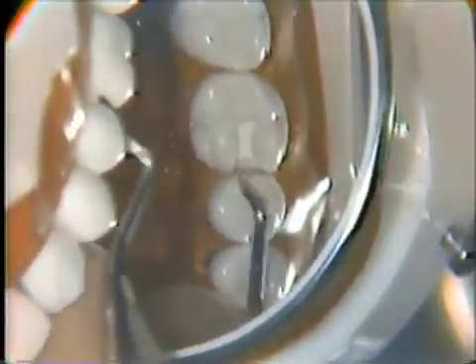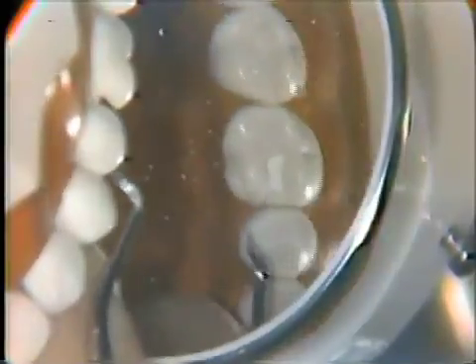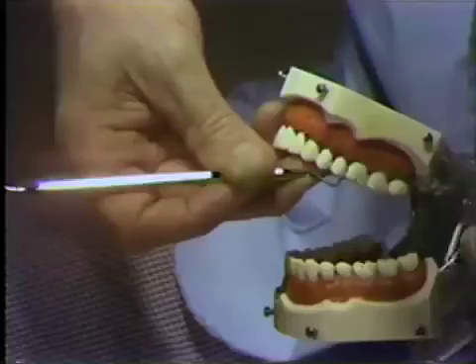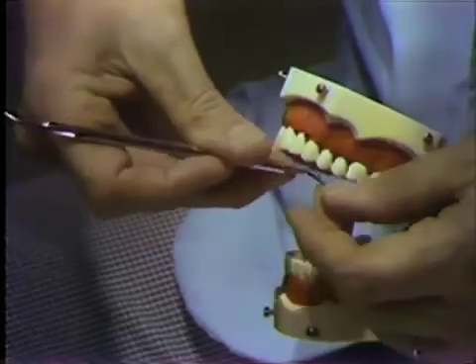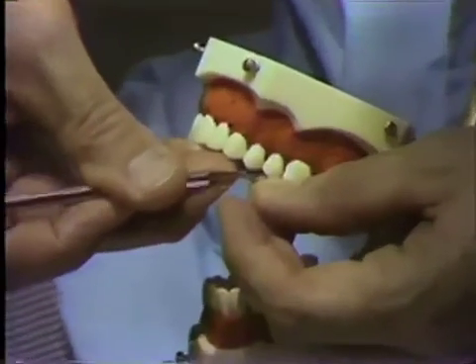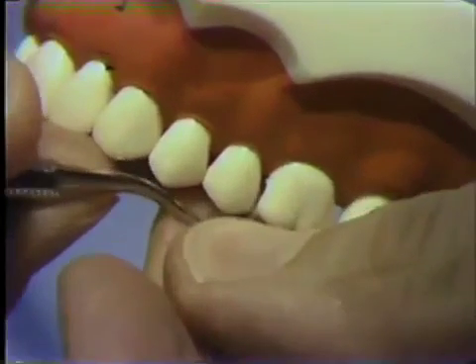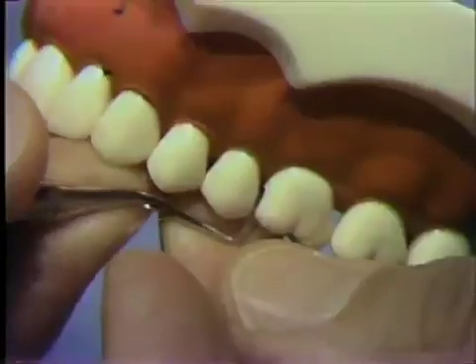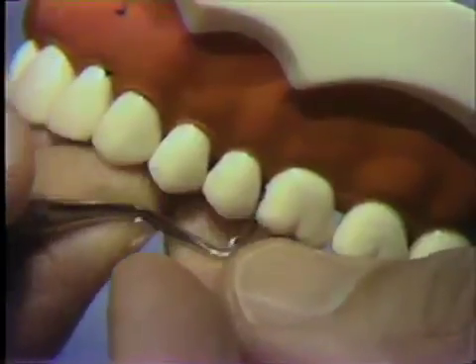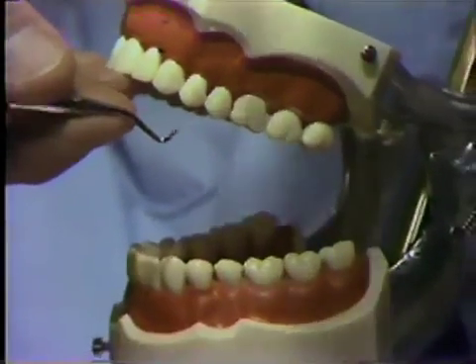In completing this sequence, we would also utilize the same instrument with the lateral scraping action to blunt or round over the axial pulpal line angle. The mirror position may be modified, or eliminating the mirror and utilizing the instrument with a two-hand grasp with direct vision is an excellent way of utilizing the trimmer in refining the cervical floor. With the left hand stabilizing the instrument, better control and direction can be achieved. This completes the refinement of the Class II amalgam preparation utilizing hand cutting instruments.